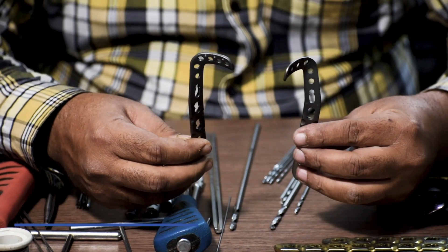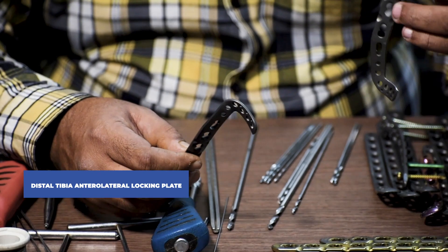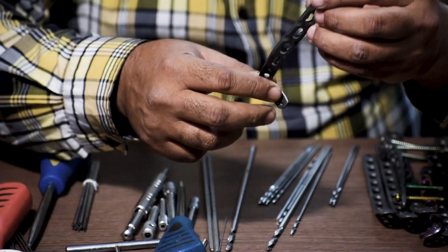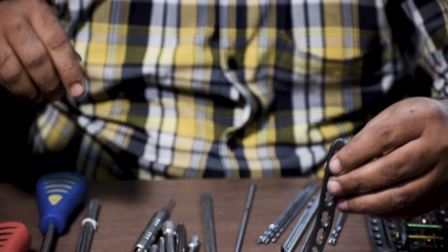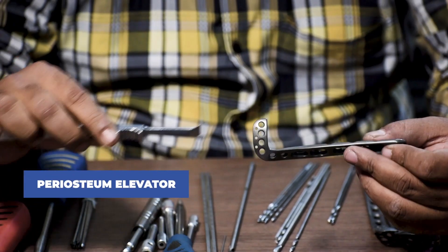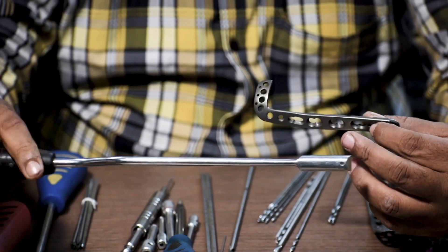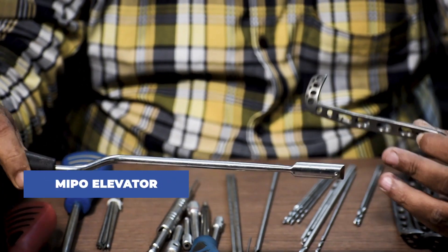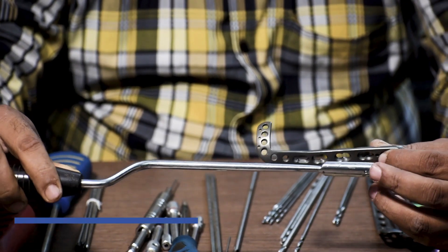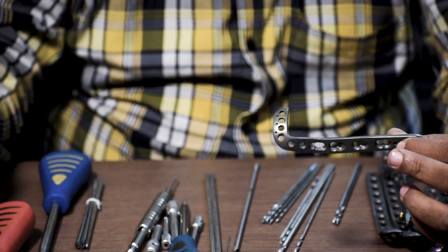This is a distal tibia anterolateral locking plate. This plate is used to fix the fracture from the anterior and lateral side, that is why it is called an anterolateral plate. To fix this plate, first we have to provide an incision in the fracture site. After the surgeon performs the incision, a periosteum elevator is used to lift and separate the periosteum from the bone. After this step, a MIPO elevator or tunneller is required — that procedure is called MIPO, which stands for minimally invasive plate osteosynthesis. This is inserted in the fracture site for tunneling.